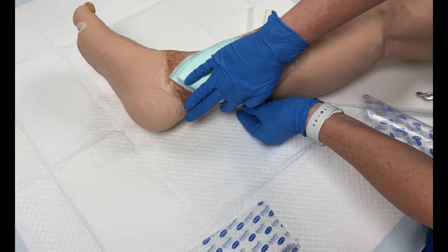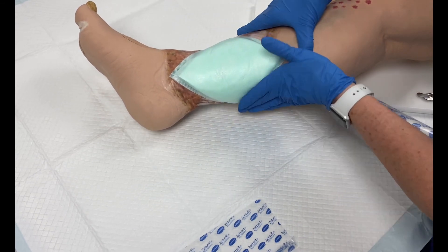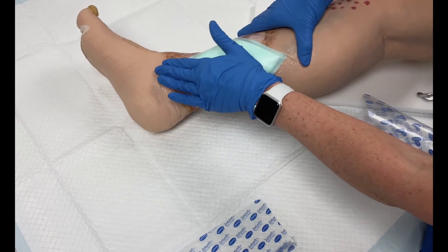The dressing application is now complete. Both Sorbolgon and Zetivit Plus silicone border dressings can stay on the wound for up to seven days.